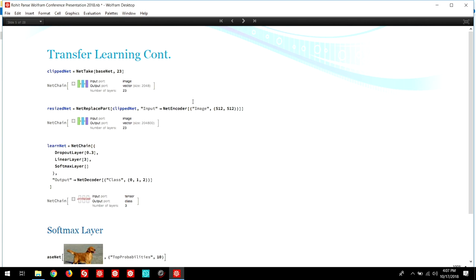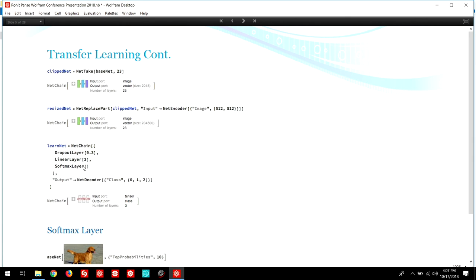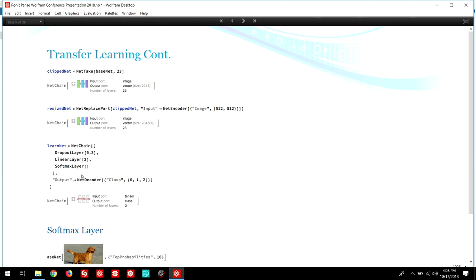Next, I added three layers to the neural net. The ResizeNet here will extract features from the dataset. This new neural net, called LearnNet, will be used to interpret the features and output what it thinks the input image is. The three layers that will do this are the linear net and softmax layer that I explained earlier and the dropout layer. The dropout layer is a component of the neural network that prevents co-adaptations of the neural net by randomly dropping out layers when training the net. This is a crucial part of the neural network because it's used to help the network improve its accuracy and reduce overfitting, or the tendency of a neural network to be extremely specialized to a limited set of data points. In other words, this neural net becomes very good at recognizing images in the dataset that you've given it to learn with. Overfitting is not desirable because it makes the neural network very inefficient on data points outside of the training set. Additionally, I specified the output as 0, 1, or 2. 0 means a normal chest x-ray, 1 means viral pneumonia, and 2 means bacterial pneumonia.